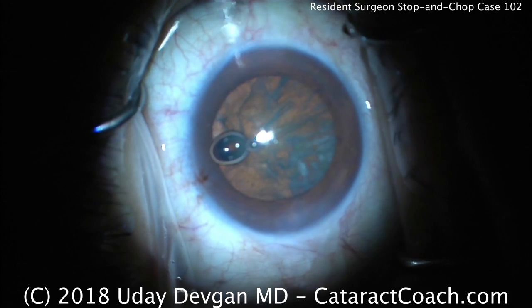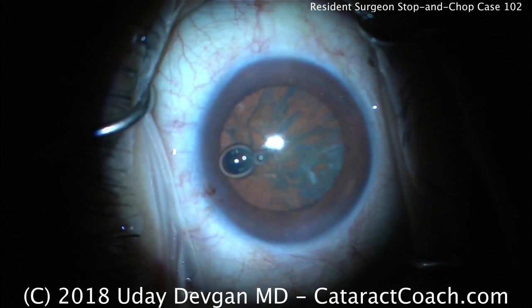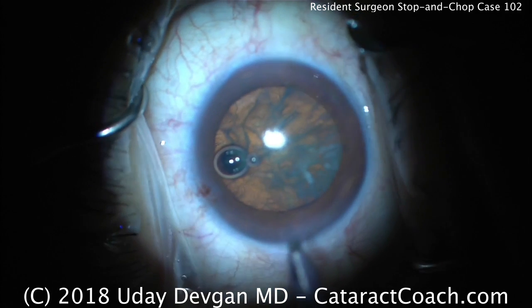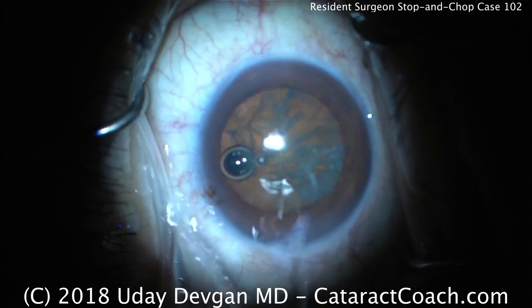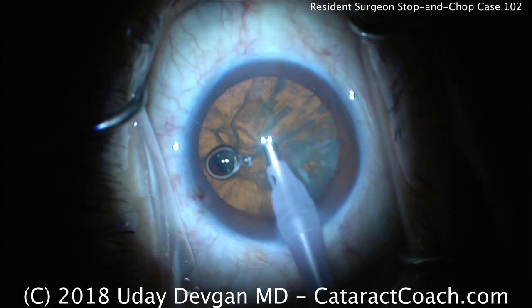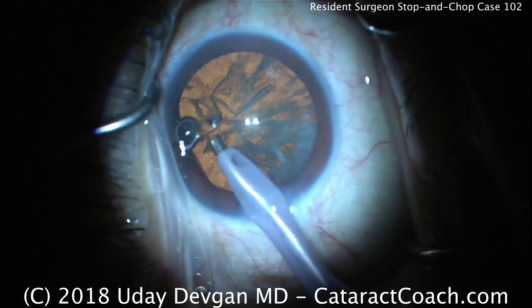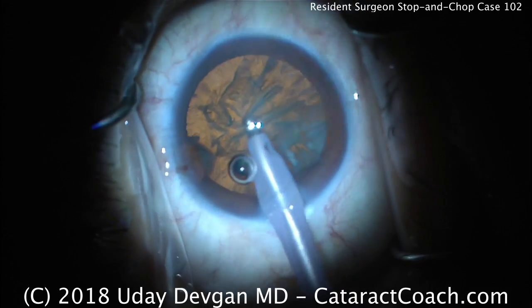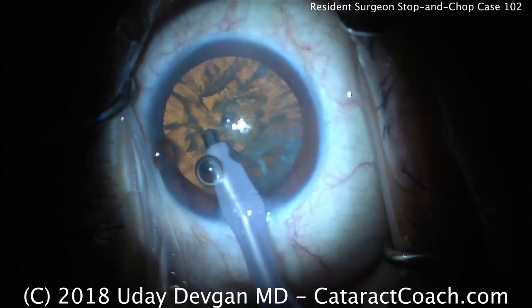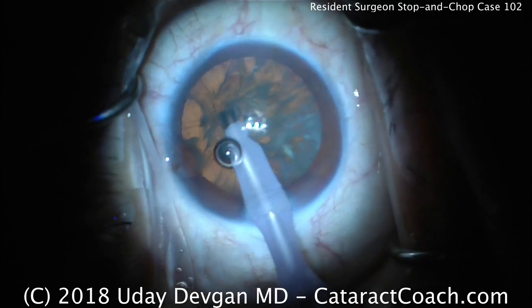The resident has decided to do a stop-and-chop technique. Adjusting the phaco probe — this first setting will be more of a sculpt setting: moderate power, low vacuum, low flow. You don't need to vacuum a lot of material away or run a lot of fluid through the eye; it's primarily using energy to sculpt that groove. There's taking out the air bubble — that's also removing whatever little viscoelastic is left. Bevel up on the phaco probe, cleaning up a little bit of the anterior cortex. Time for the first groove.